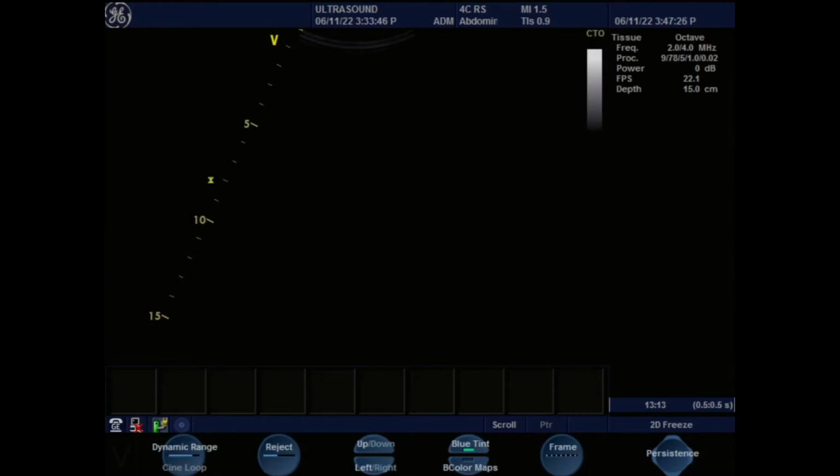So I think if you guys want to come up a little bit, maybe on this side or that side, in a way that you can actually see Tasneem scanning, how she's placing the probe, where she's placing the probe, and what kind of image is being generated from it. We do have this projected on the screen also, so hopefully it will help.